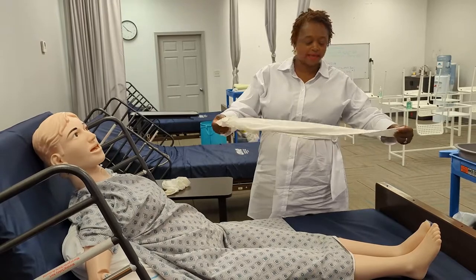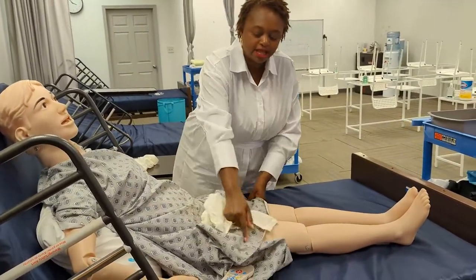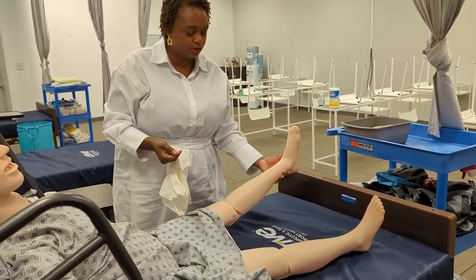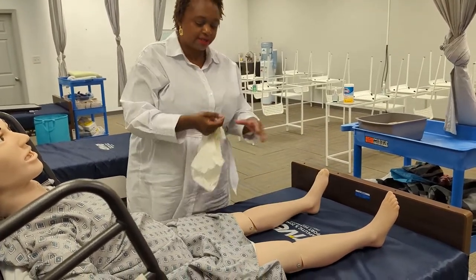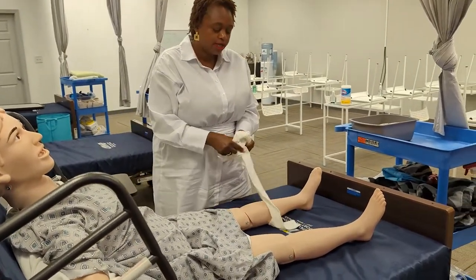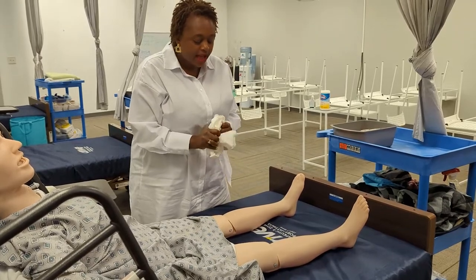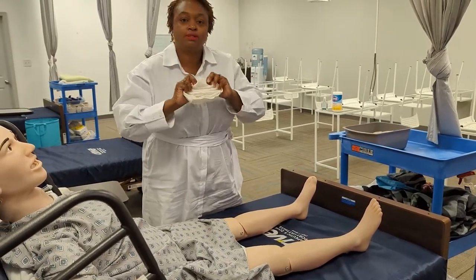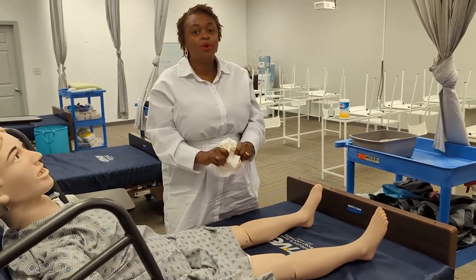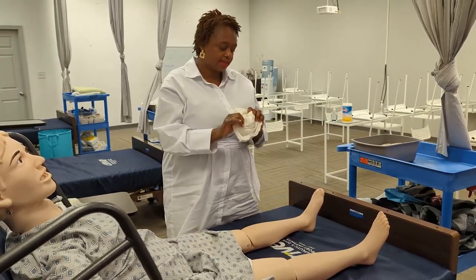I had knee highs somewhere, but I can only find the thigh highs for the video. Since these are thigh highs, I would lift the johnny up a little bit. Always be mindful of where you hold someone — here I would hold at the ankle, at the joints. These are extremely tight and difficult to put on. I gather them in my hand, and you can see it's like difficult to stretch — that's the correct fit for compression stockings. You can see the toes are open; that's to check circulation.